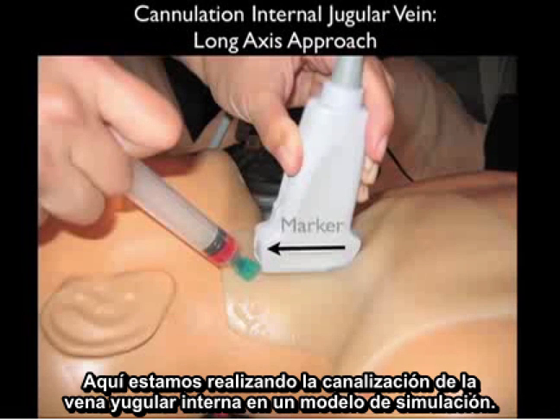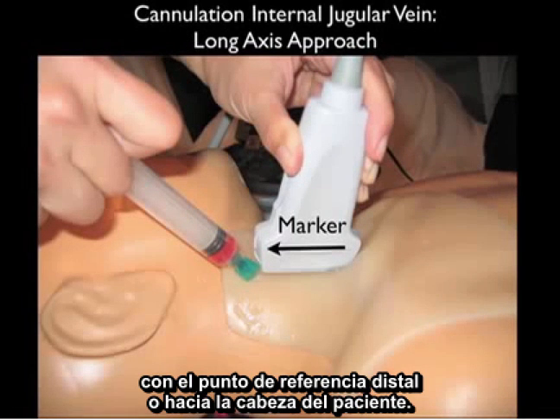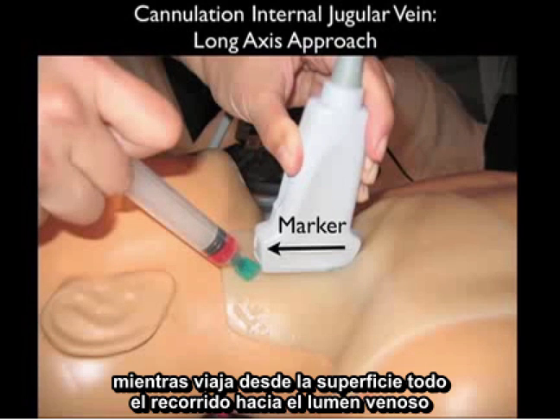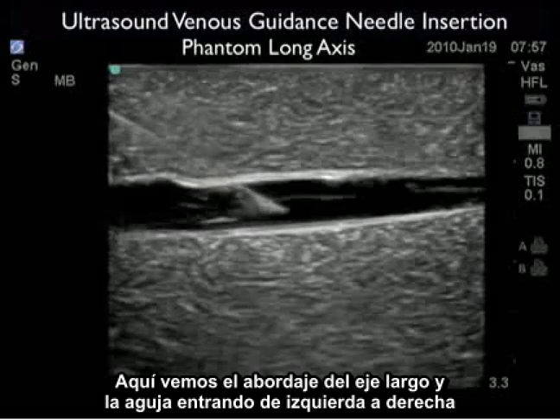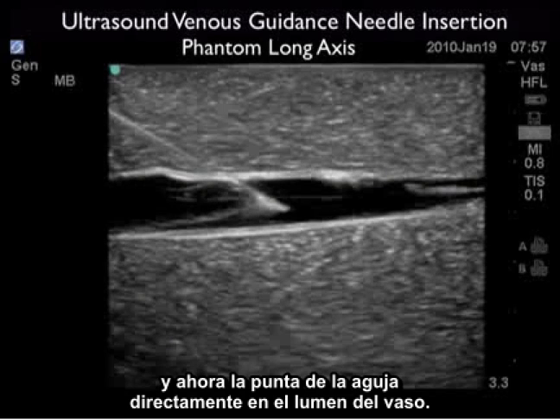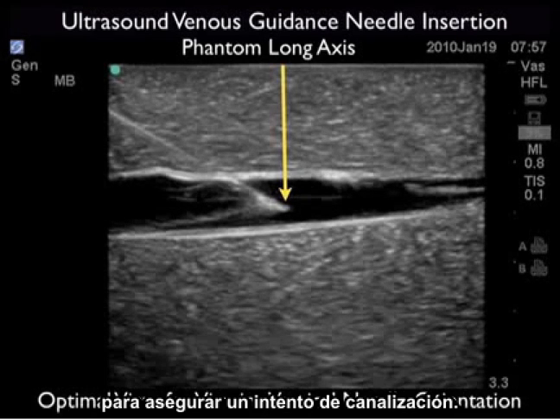Here we're performing cannulation of the internal jugular vein on a simulation model. The probe is oriented along the longitudinal or long axis course of the internal jugular vein with the marker dot distal, towards the patient's head. The needle comes in at a 45 degree angle underneath the distal aspect of the probe. This allows us to see the entire aspect of the needle as it travels from the surface all the way down to the venous lumen. The long axis orientation is excellent for seeing vertical needle depth — notice the needle coming through the anterior wall with the tip squarely within the vessel lumen, allowing us to plan the optimal depth for a secure cannulation attempt.